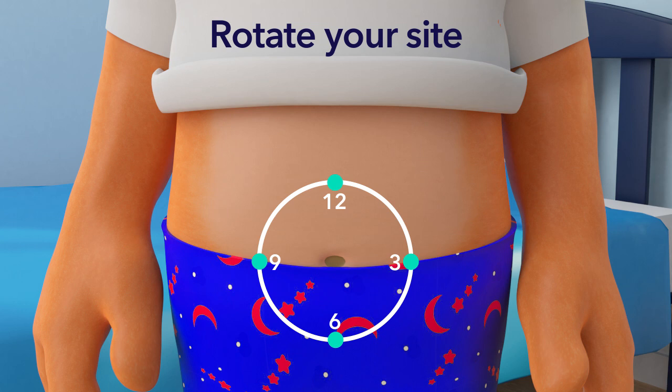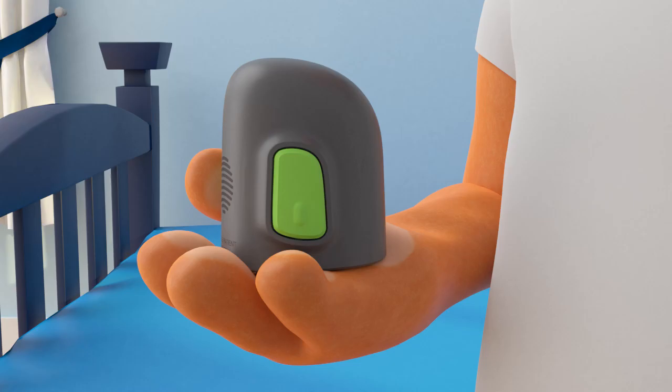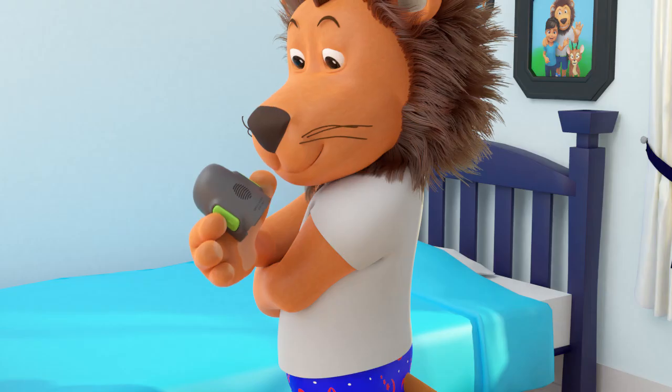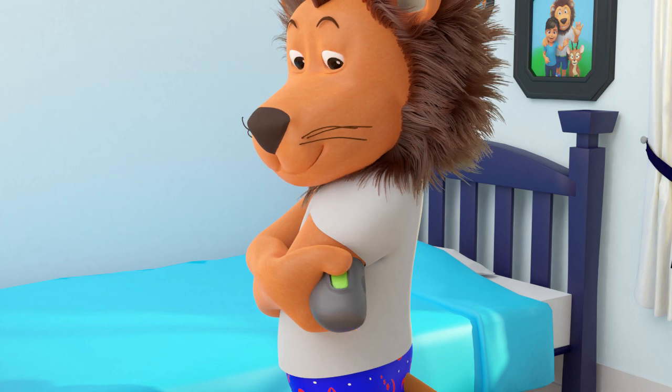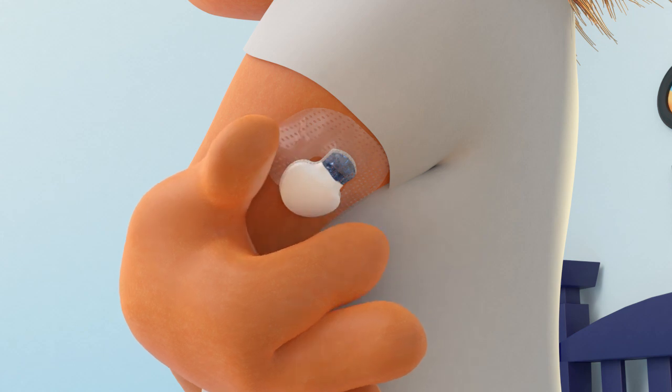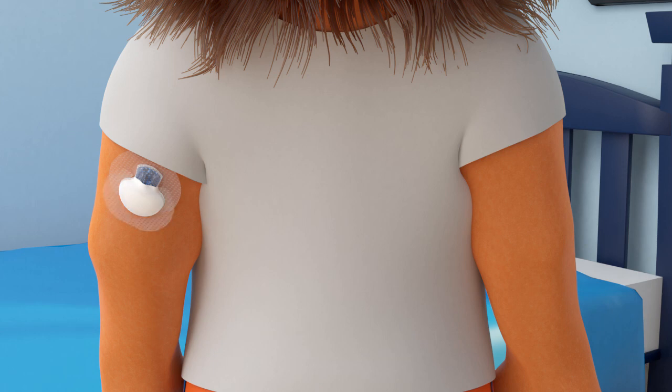Your parents can help place the sensor at the back of your arm or your belly using the Serta. This is what Lenny's Serta looks like. Your Serta may look a bit different, and that is okay. With a little bit of practice, you'll be able to use your Serta just as easily too. To insert the sensor, put the Serta on your arm and press the two green buttons at the same time. Your parents will help you connect the white transmitter to your sensor and tape it all up so it stays secure to your body. The transmitter sends your glucose reading from your sensor to your pump via Bluetooth.